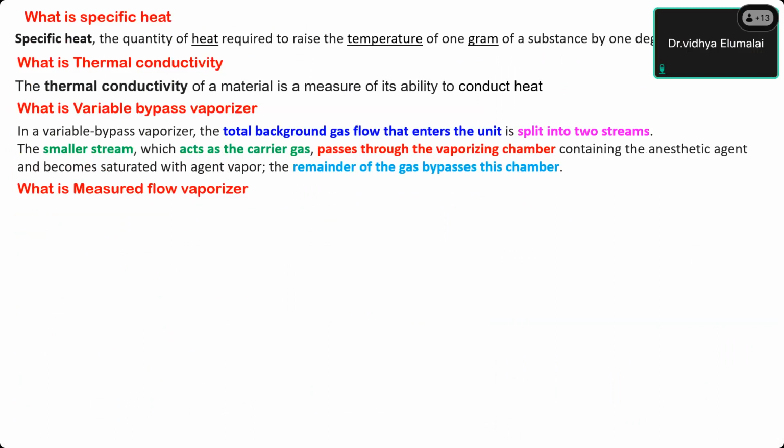Here it is the quantity which is fixed. I said the definition in the last class very clearly. Let me see how many of you remember that. The vaporizer output and diluent gases are dialed separately. There is no fresh gas flow directly entering the vaporizer at all.